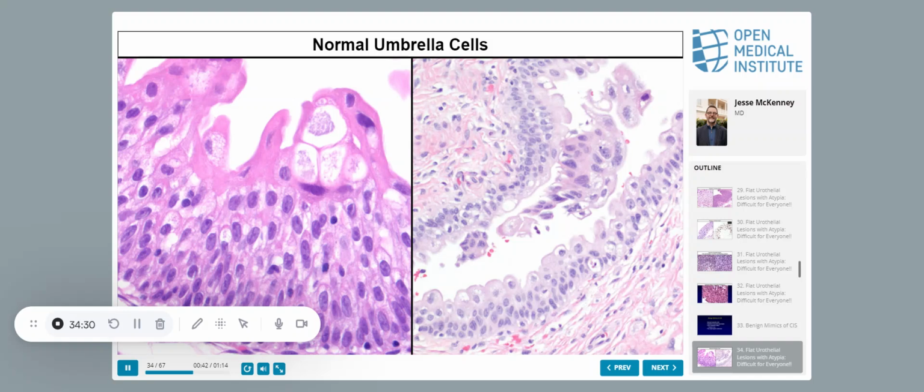Now, if you cut these tangentially, it's going to look like this. That looks quite atypical, right? You have to realize, see the vacuolization? They basically cut these umbrella cells, so you're seeing a sheet of them en face. Does that make sense? Do y'all know what en face is? It's where the knife is cutting in plane into the screen, so you're just seeing a sheet of them.